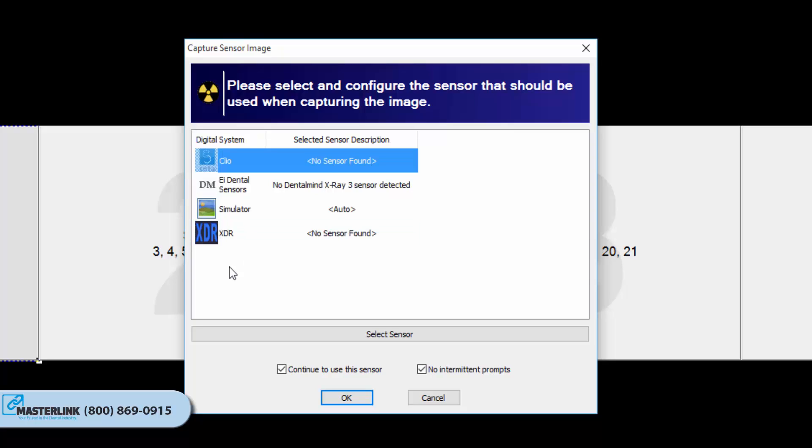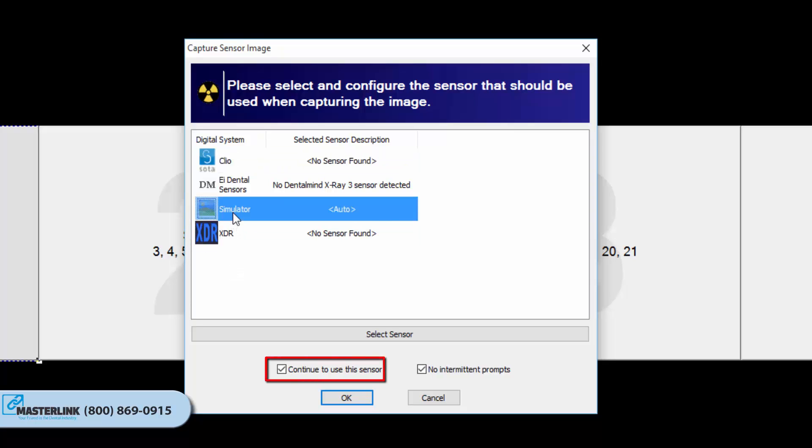The list of hardware choices will depend on the Capture Source on the layout tiles. Select Continue to use this sensor/source if all images in the layout will be captured using the same hardware source. If unchecked, the user will have to specify a hardware source between each Capture in the series.